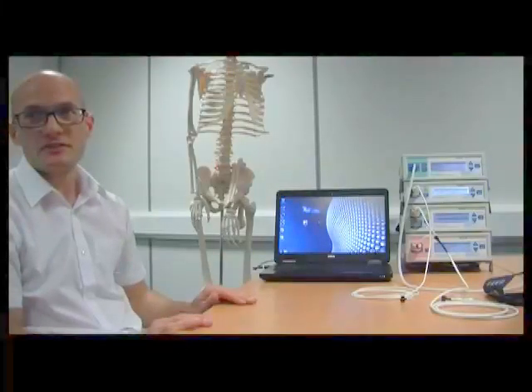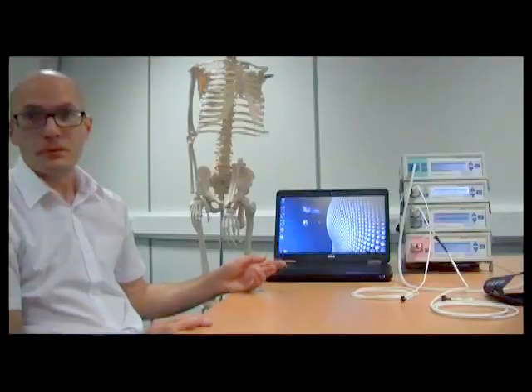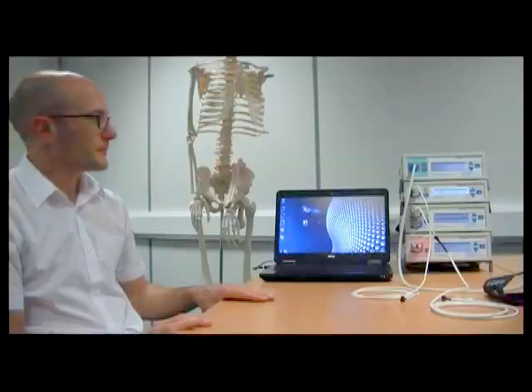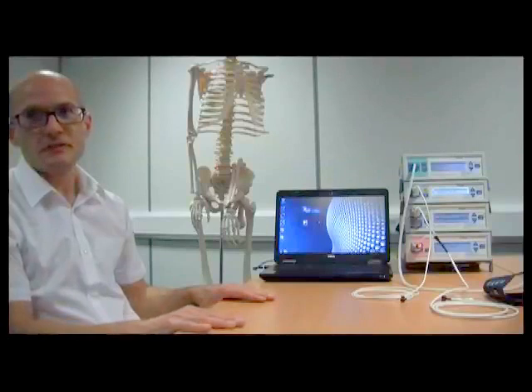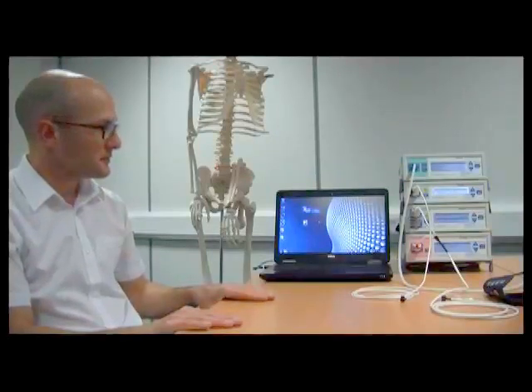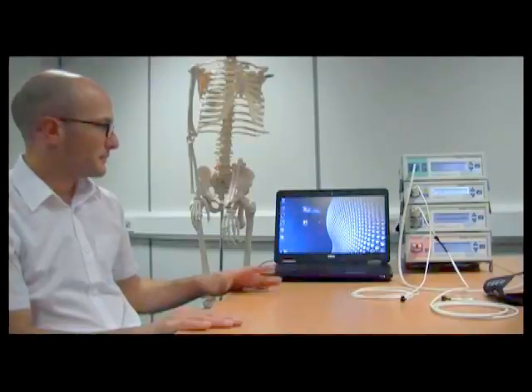Good afternoon and welcome to this demonstration where I'll be demonstrating laser Doppler, tissue oxygenation and pressure cuff provocation to test post-occlusive reactive hyperemia. To do this we'll be using these blood flow devices and the moorVMS-PC software.